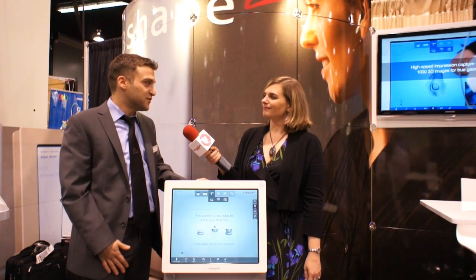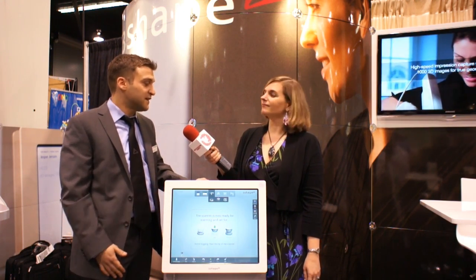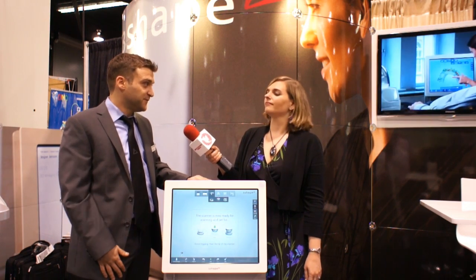What product are you excited to showcase today? I'm really excited to show you 3Shape Trios, the next generation intraoral scanner. Can you show us how it works? Of course I can. So Trios is quite easy to use, the interface is really friendly, it has a multi-touch screen, and I will show you now the scanning procedure.